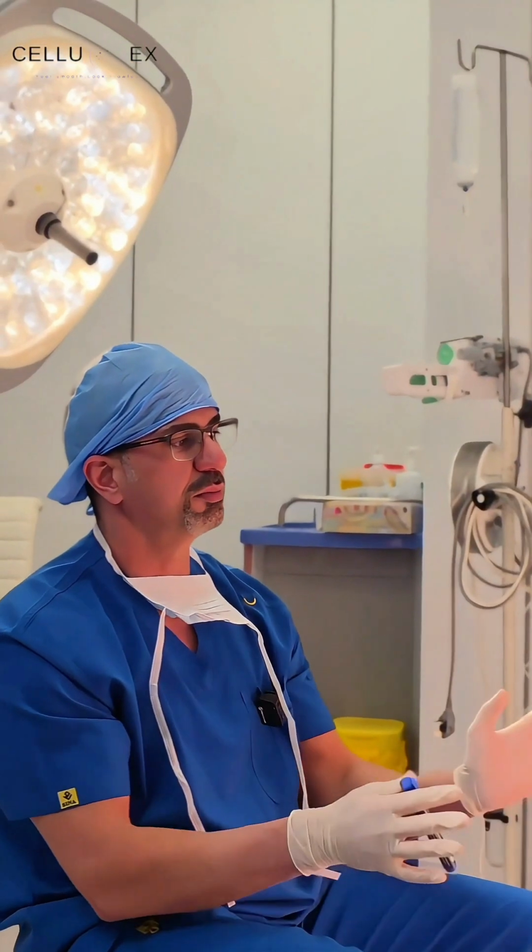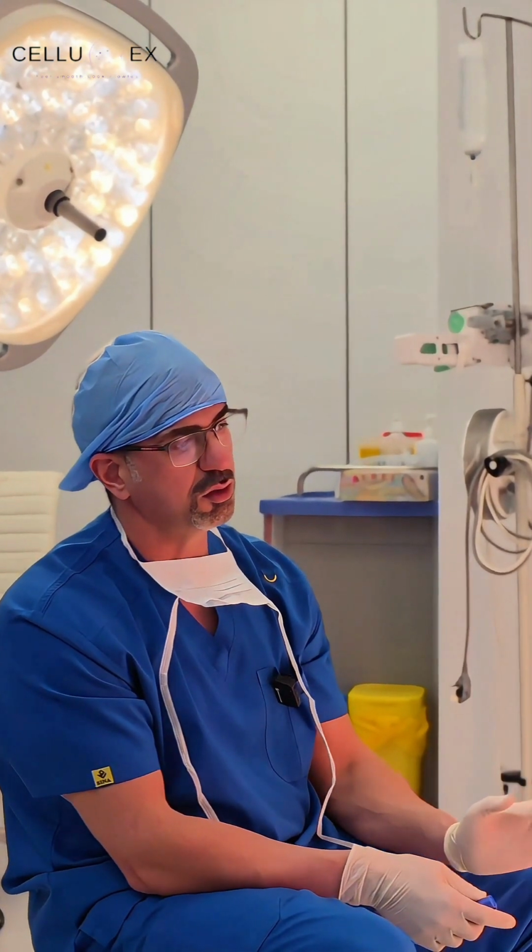The most important part is to take pre-op and post-op pictures. When do I recommend to take the post-op pictures? Three months post-procedure, because the result will show after three months. And you have to have the documentation so you can show the patient the difference after three months.